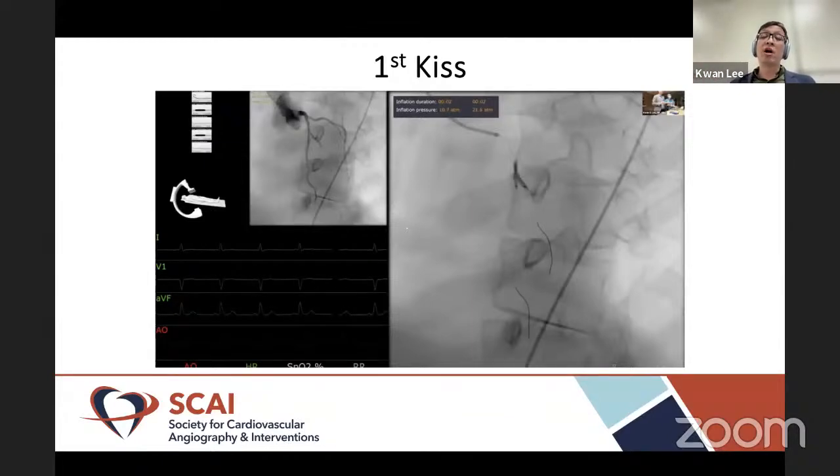It's very important to not have asymmetrical balloons with regards to the lineup. Both balloons should end proximally at exactly the same point. The markers should be at the same point. I've seen people have a balloon kind of go halfway out and then another balloon on the main branch without symmetry, and that's not quite right.